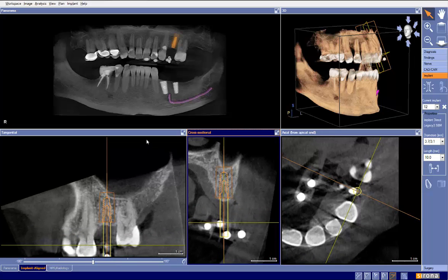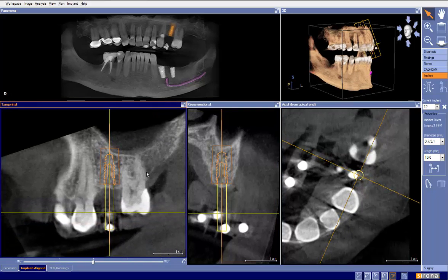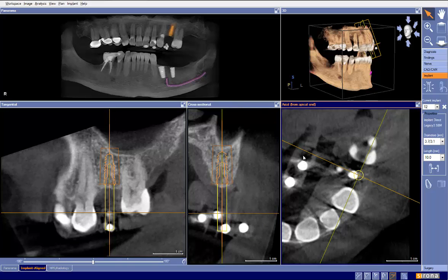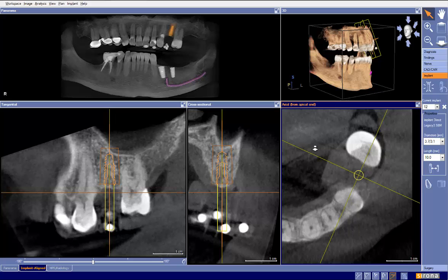So if we were to take a look at this plan as it is right here, I certainly would say that we would all have a tendency to say this is a very good plan. Mesiodistally, it's separated. Maybe it's a little close to this root and needs to go over a hair, but generally speaking, it's pretty good. And bone-wise, this implant is well in the bone. Now, what we don't have an idea of here is how it is restoratively. So the only way to really know that is to look at the axial view and or bring the CEREC data in.